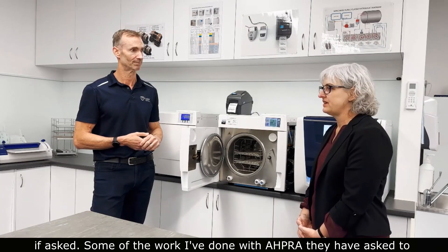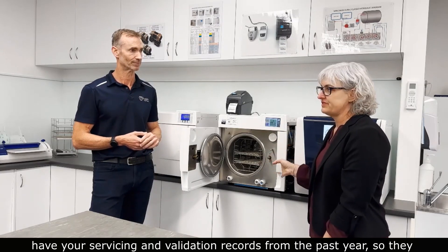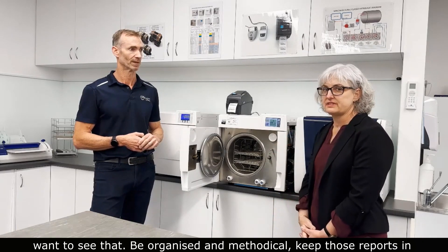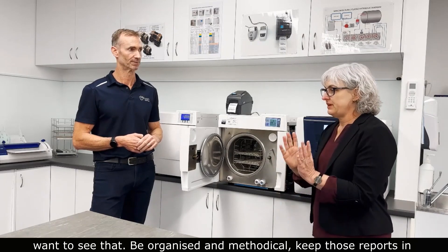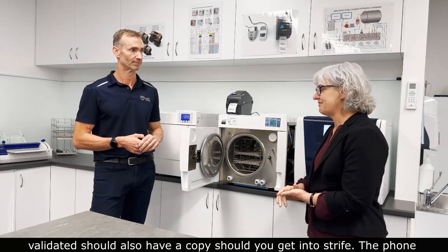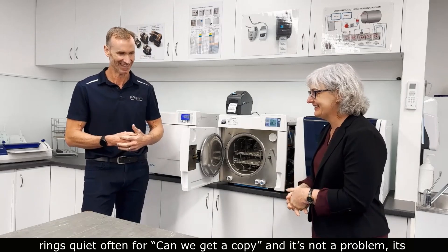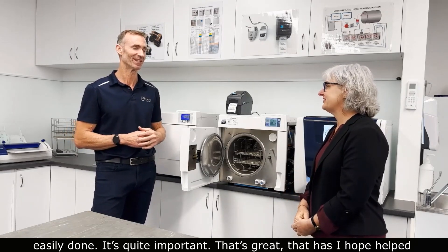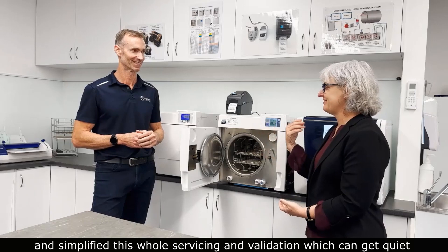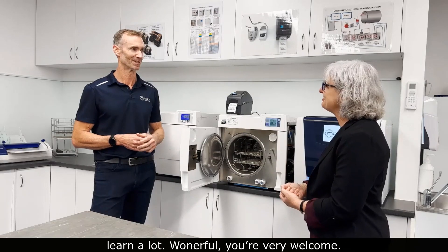In work with AHPRA, they have asked dental practices for every steam steriliser on the premises: can we have your servicing and validation records from the past year? So being organised, recording, and keeping those reports in one place — and backing them up — is very important. The company that serviced and validated the machine should also have a copy. Hopefully this has helped simplify the whole servicing and validation process, which can get quite confusing, but the importance behind it is clear.